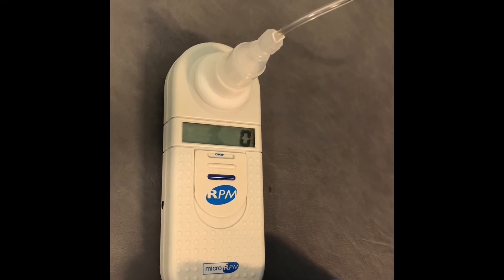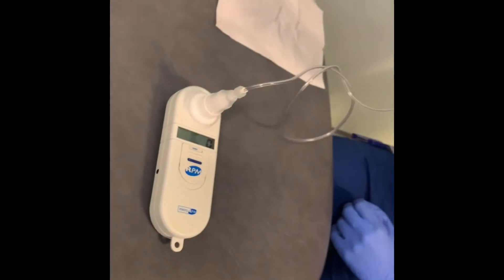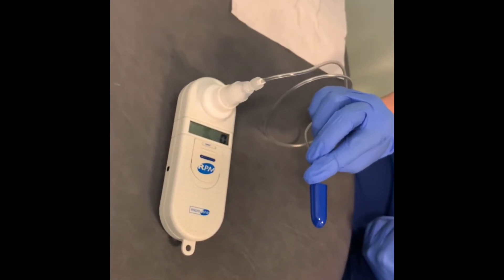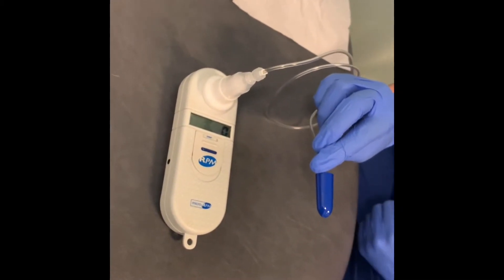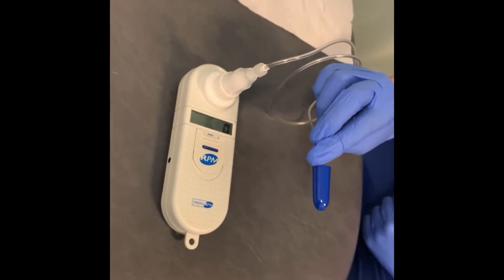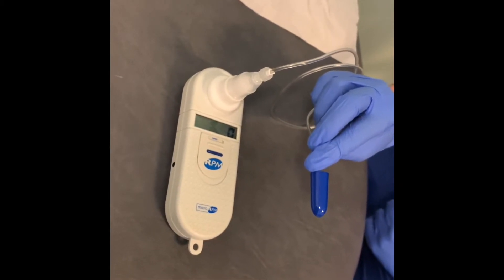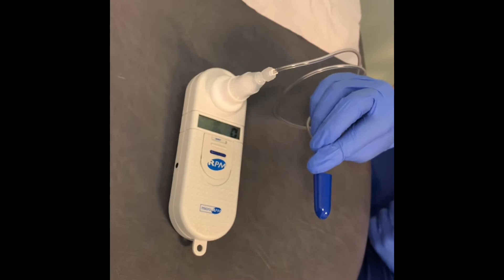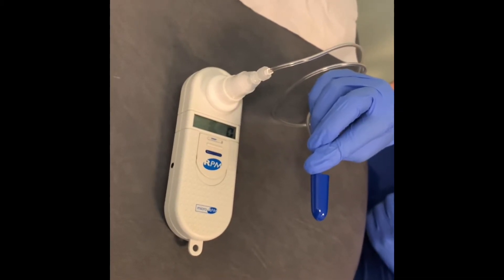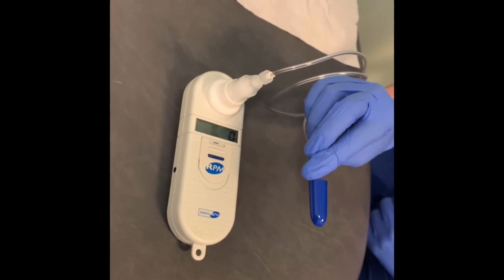How do you tell what size of probe you need? There are different sized probes — size 1, 2, 3 and 4 with this device. Have a look at the patient's nostril size. Generally for adults, you use size 3 and size 4. It's always better to use a slightly larger probe so that the probe completely occludes the nostril.